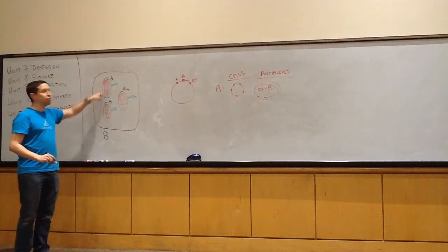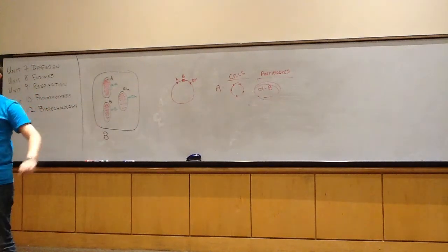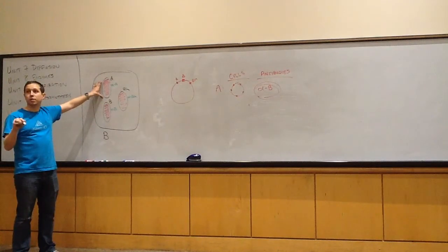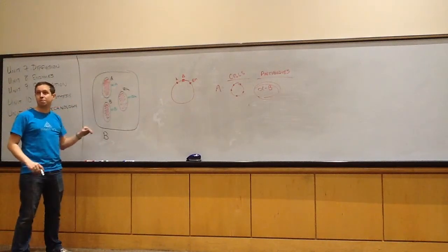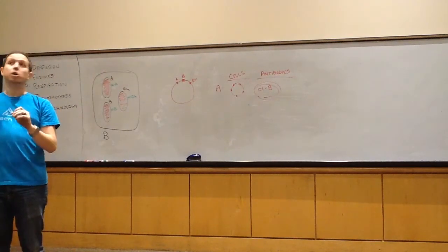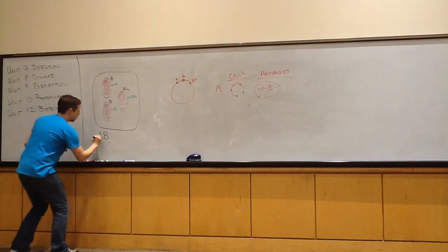What if I saw a reaction in both of those wells? What kind of blood would they have then? AB. What if I saw a reaction in neither of those two wells? O. Okay? Now, so does everybody understand? If you see agglutination, you write that letter down. If you don't see agglutination, you don't write the letter down. And if you get through both of these, A and B, and you haven't written the letter down, you write O. If, however, you write down A, and then you also see a reaction in B, you also write down B. So this type of person here, I would write that person down as AB.